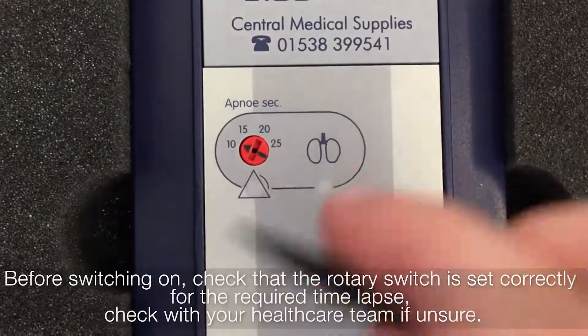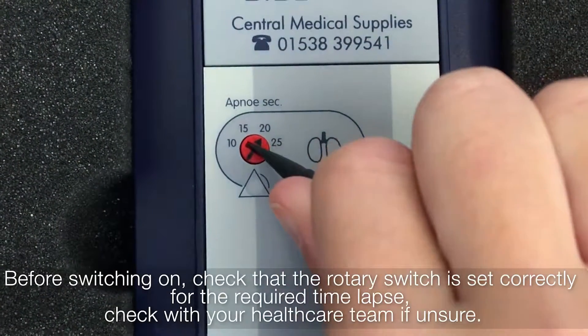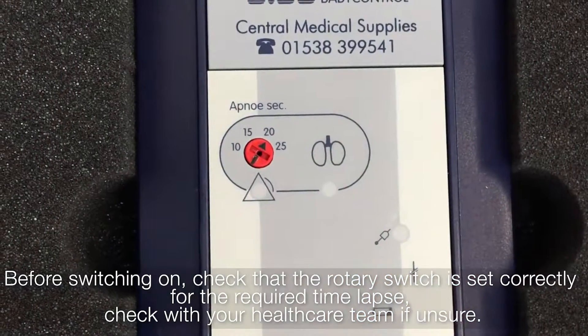Before switching on, check that the rotary switch is set correctly for the required time lapse. Check with your healthcare team if unsure.